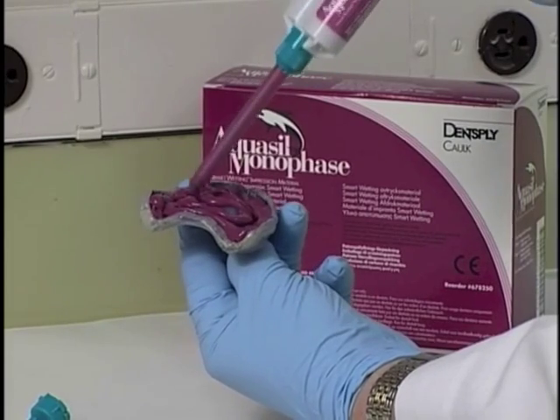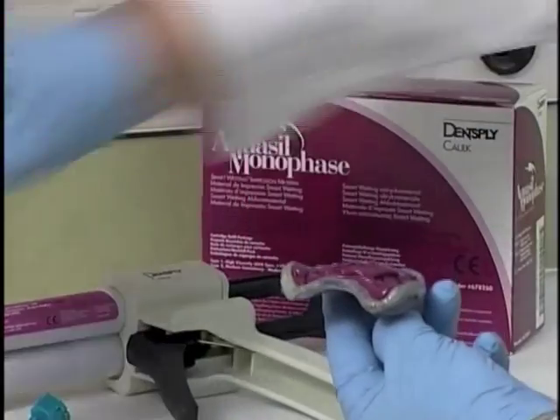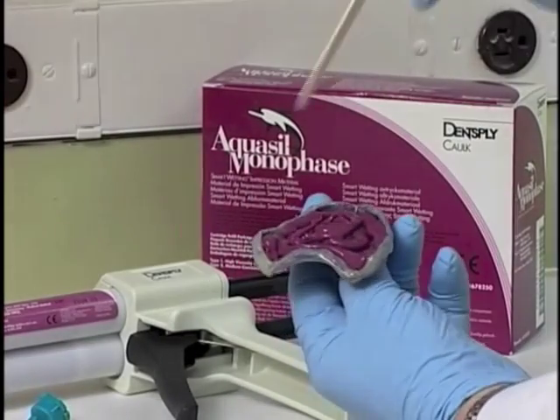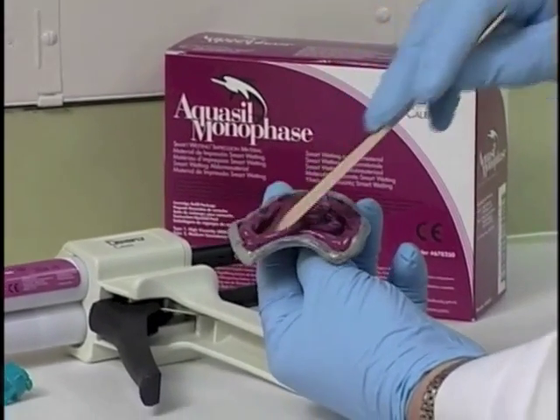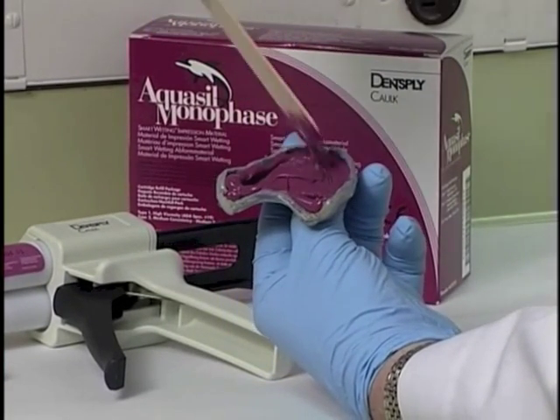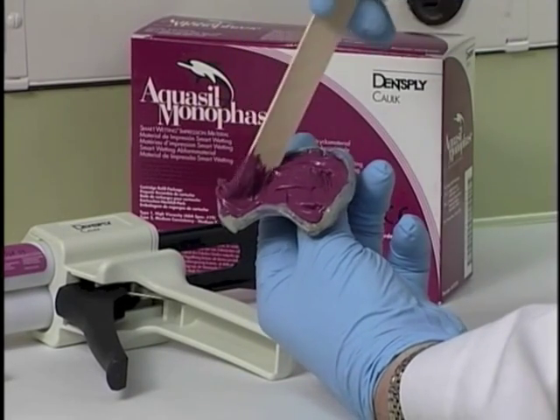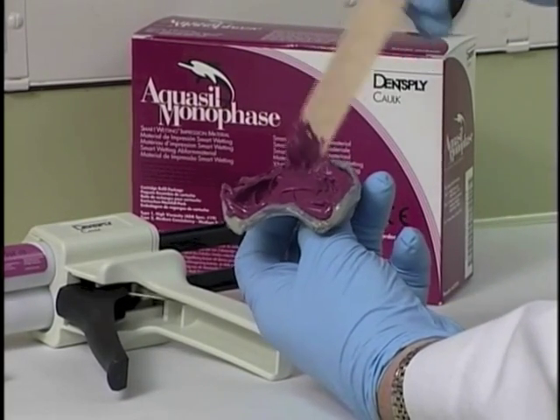About that much should be an adequate amount, I would think. And then we take a tongue blade and we smear the material across the palate, just making sure the tray is loaded properly. And then we drag the material from the ridge up onto the periphery all the way around.